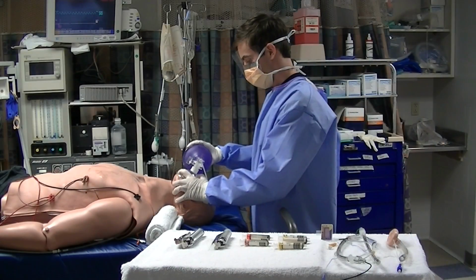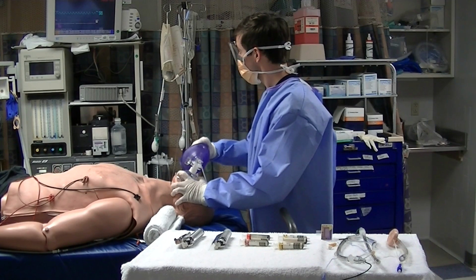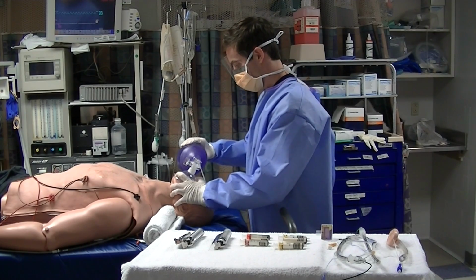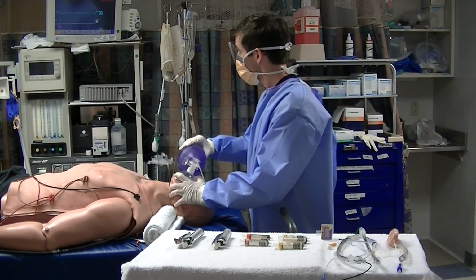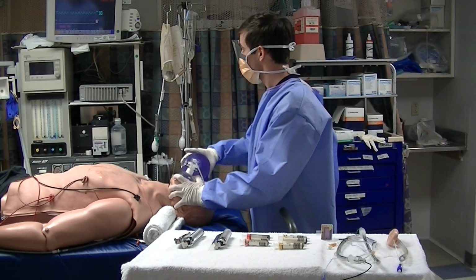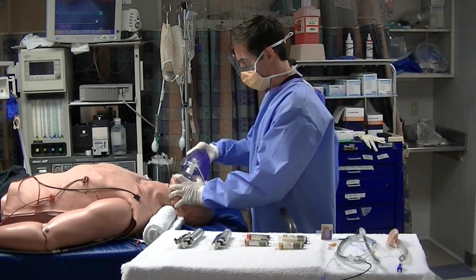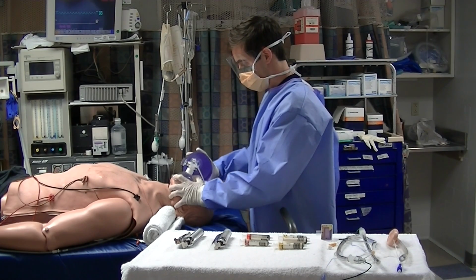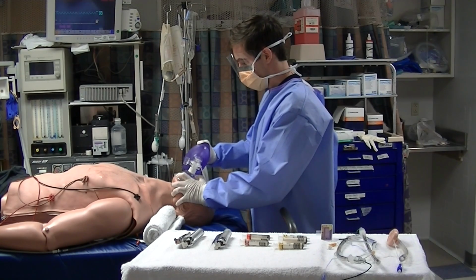This is an example of an ideal setup when intubating a patient. The practitioner is using gloves, gown, and a face shield to ensure that he's adequately protected. Note that each bag of the bag valve mask occurs about once every 6 seconds, which is the normal physiological respiratory rate. Note the practitioner's single-hand C grip, in which he uses his thumb and index finger to grab the mask and his 3rd, 4th, and 5th digits to grab the inferior part of the mandible.